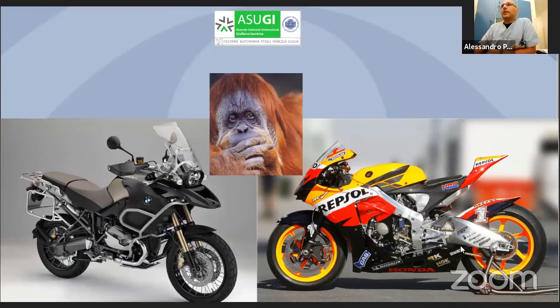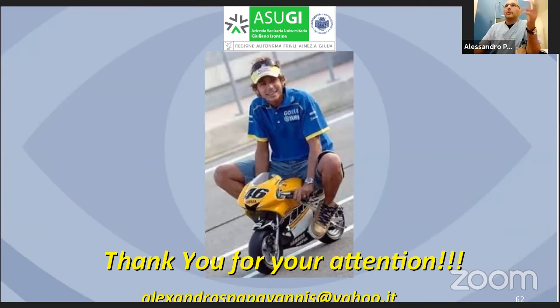So I want to end by saying that it's not important what type of angio-OCT you use. You need to know that any machine, any instrument has different characteristics, and we need to know how to use these characteristics to the maximum. So it's not important which machine you select, but it's important to know how to use it to the top.